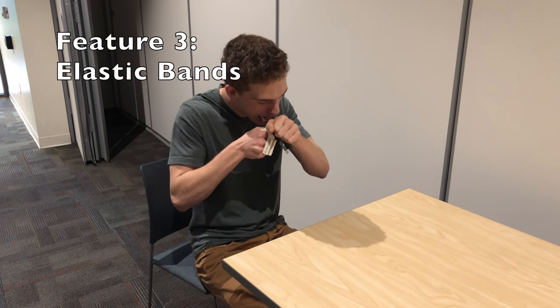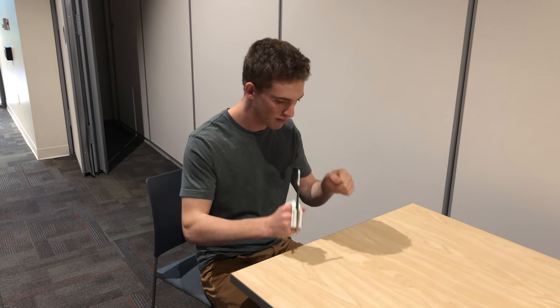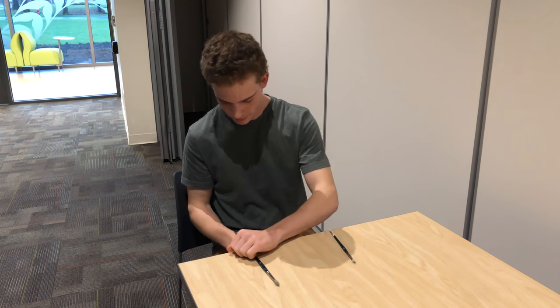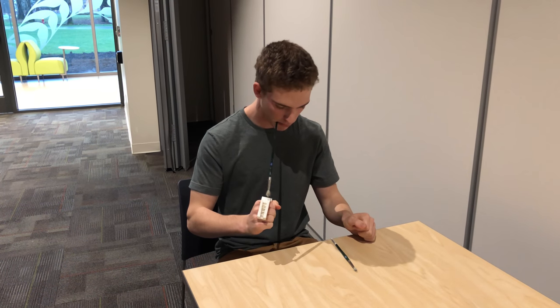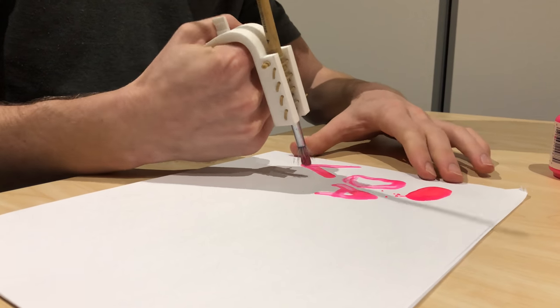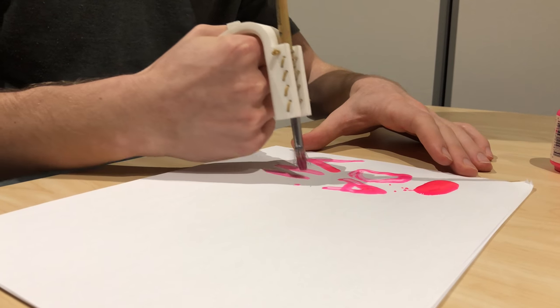The paintbrush is secured by elastic bands. This makes the paintbrushes easy to attach and provides enough friction to keep the brush in place. It also allows for different sized brushes to be held. The DaVinci keeps the paintbrush close to the hand, maximizing control. The user can also paint at different angles.